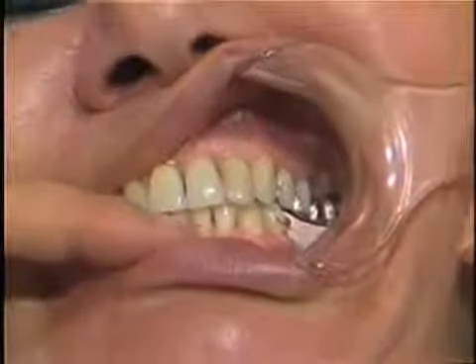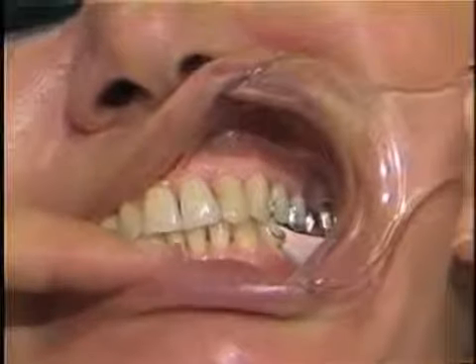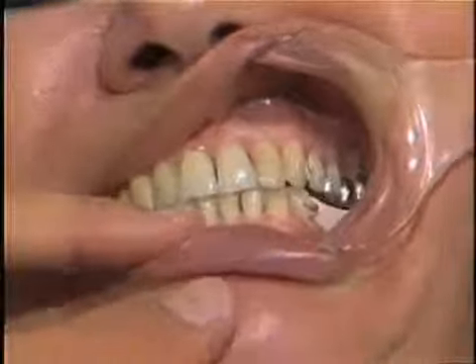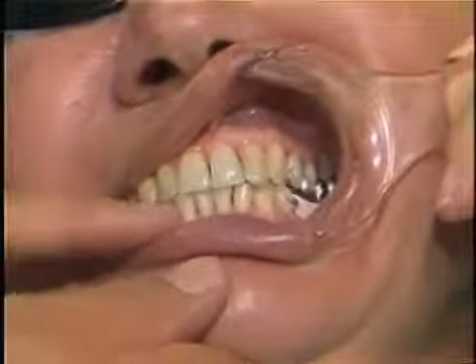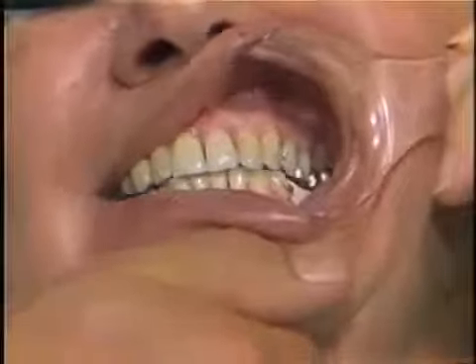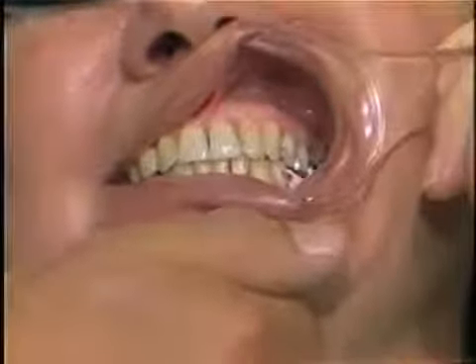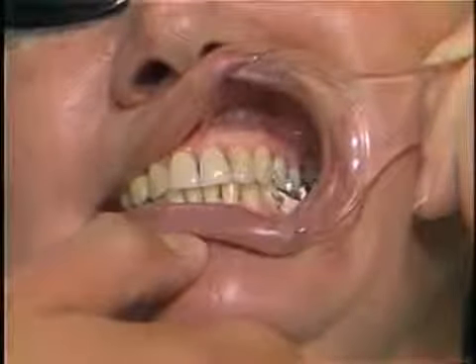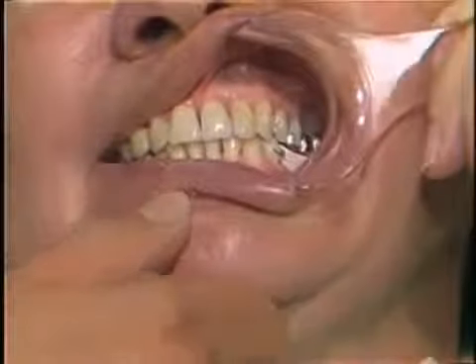It should be holding shim stock just as it did previously with the appliance out of the mouth or with the appliance in the mouth. Now move from side to side and straight forward. Does that interfere at all? Can you feel it any place? Okay. I'm going to open just a little bit, and I'll check the centric relation position. Just relax. Does that interfere at all any place? Okay. And centric relation does not interfere. Protrusive and lateral excursions do not interfere. We are set to add the wax, the recording wax, to the occlusal surface.